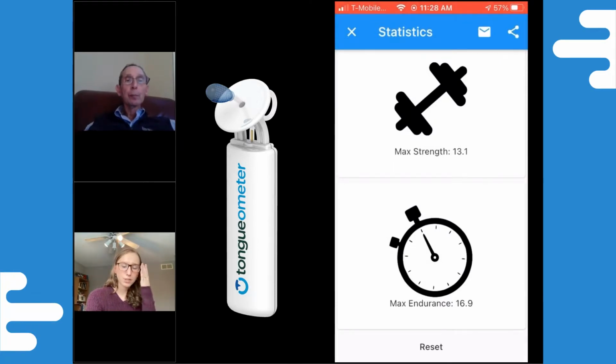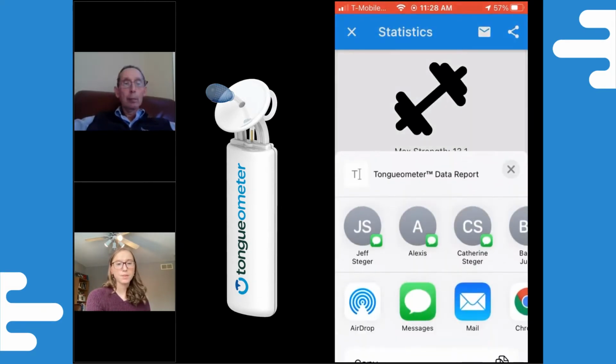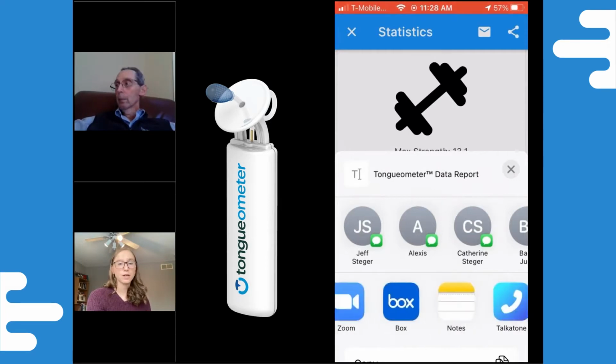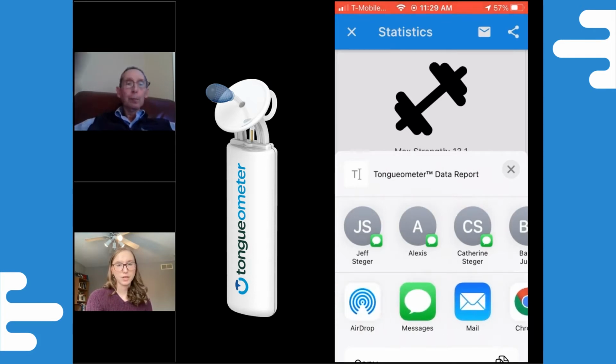There's also an option within the app to share this through other ways instead of email. So if you click the share icon, the three dots there, again, it prompts you to make sure that you want to share your report, but then it pulls up different options. So if you wanted to share it through an app called Box, similar to Dropbox, you could do that. If you wanted to WhatsApp your data report to somebody, you could do that as well. So just different ways to share that exercise report.